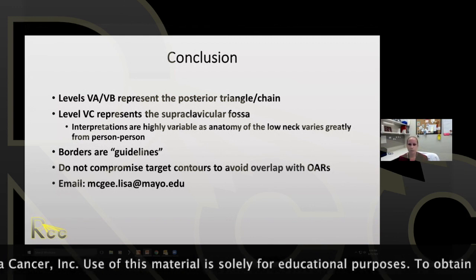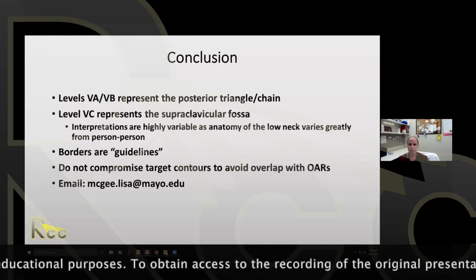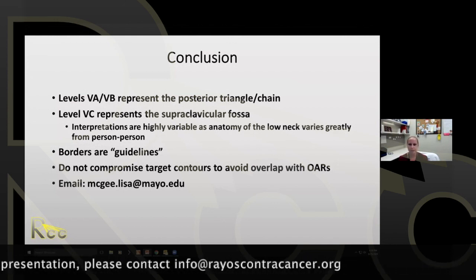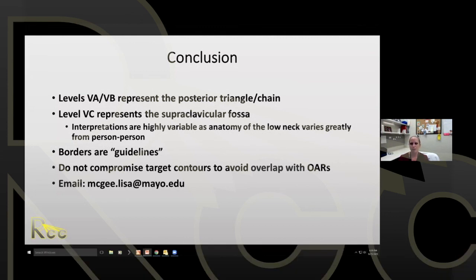full prescription dose. The way that I approach that with my dosimetry team is that I'm willing to accept prescription coverage to the brachial plexus right at that level. My goal is to limit hot spots and limit the absolute dose of the hot spot, and then also limit the volume of brachial plexus getting a hot spot. But obviously, if we have to treat those lymph nodes to 70, we're never going to meet our goal of a Dmax to 66 gray for the brachial plexus.